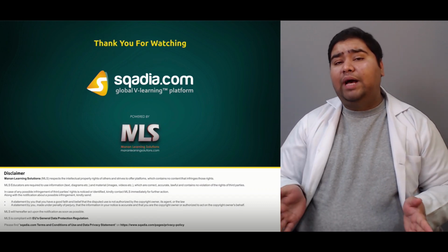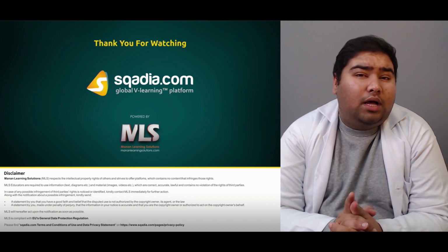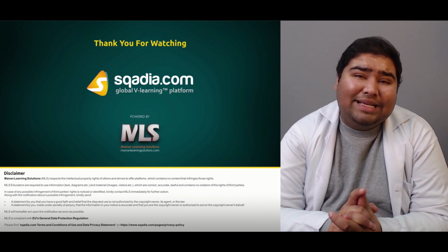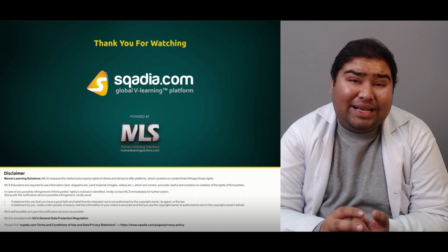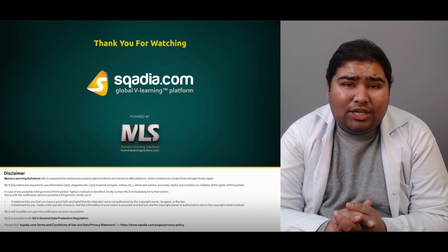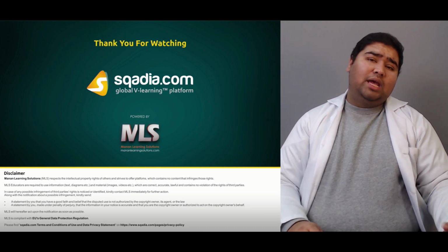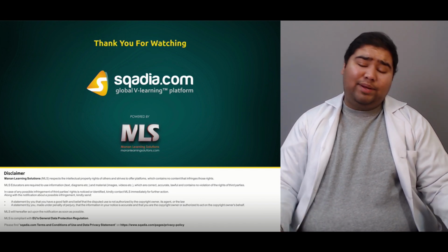In this section, we talked about the principles of diathermy. The principles of diathermy were based on the usage of electricity to generate heat. This heat was responsible for destruction of the cells. There were three different modes in which the diathermy could be used: simple cutting, extensive cutting, and coagulation. So you could use diathermy for multiple purposes as well. Then we talked about various side effects of diathermy, in which there were electrocution, fire hazards, and burns.